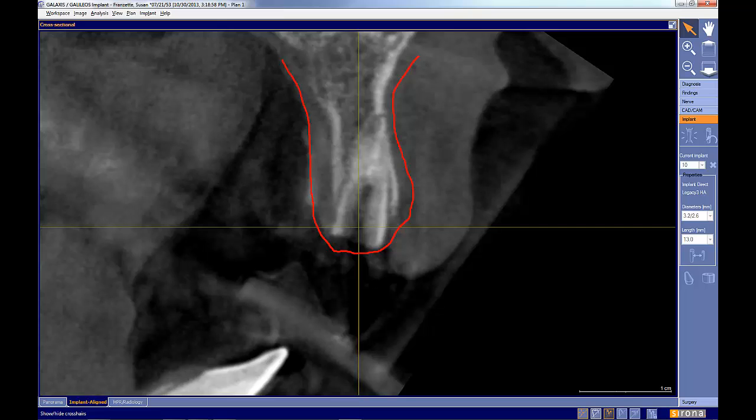And then what I would like to do is outline my bone, which looks to be about, and this is an area I want to come back to. That looks to be my bone. Now, this gives me a good mental preview of where I would like this stuff to be.